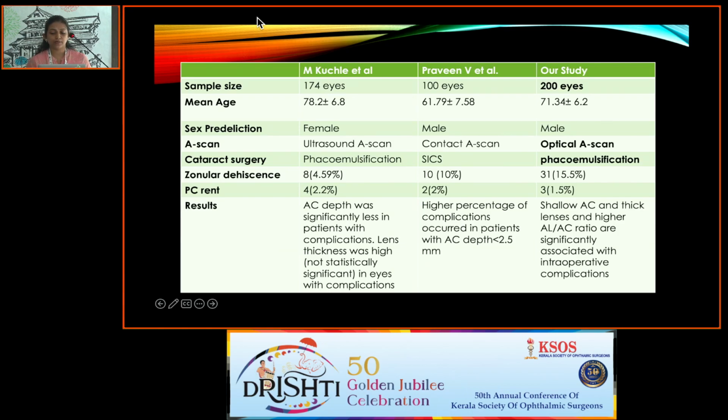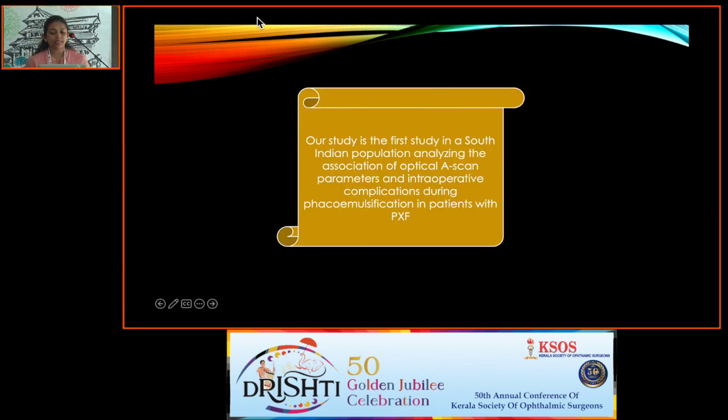Zonular dehiscence percentage was slightly higher in our population. PCR rate was similar. In all the 3 studies, the AC depth was significantly lower in patients with complications. But in our study, we also found that increased lens thickness and increased axial length by AC ratio were significantly associated with intraoperative complications. So our study is the first study in the South Indian population analyzing the association of optical A-scan parameters and intraoperative complications during phacoemulsification in patients with pseudoexfoliation.